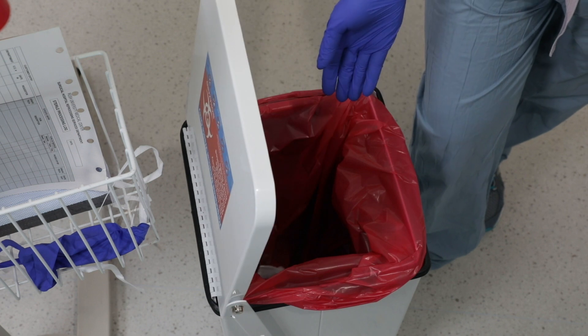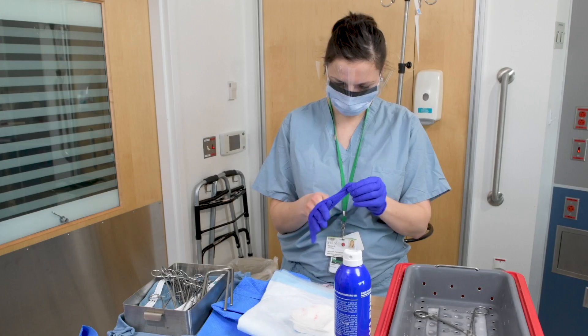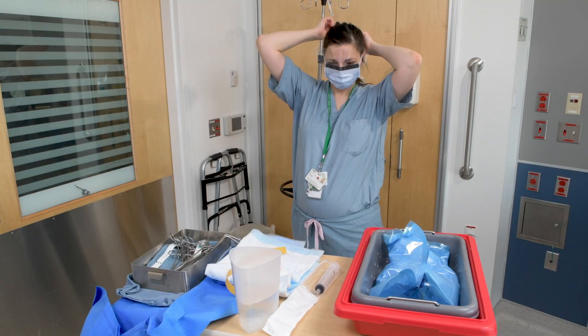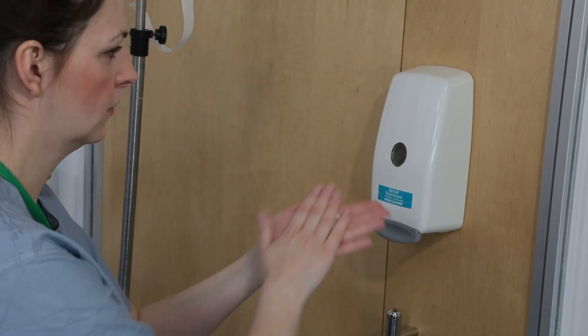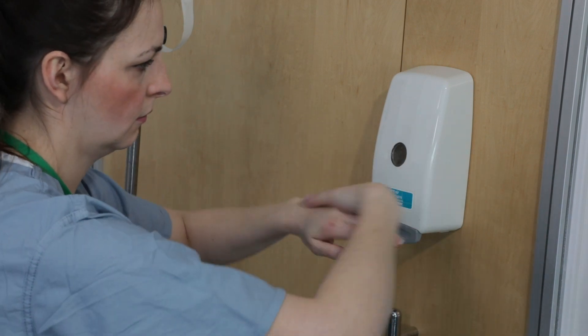Dispose of all contaminated chucks and gauze in a red bag waste container. Remove PPE and complete hand hygiene. If your hands get contaminated during glove removal, immediately wash them with soap and water.